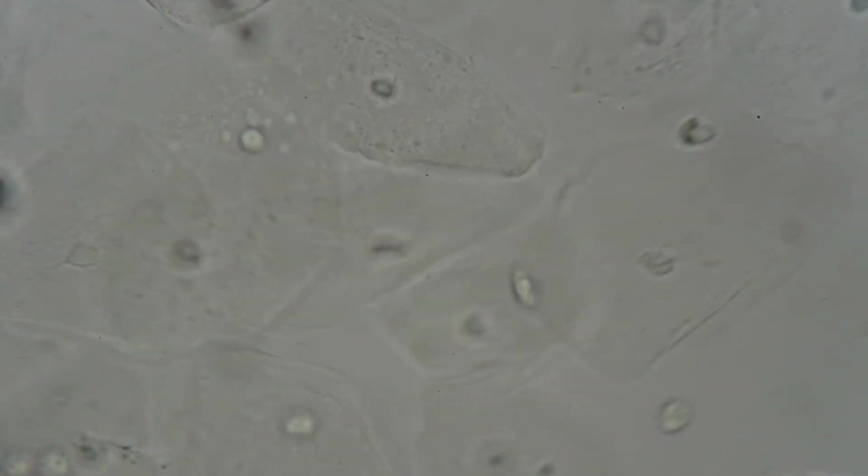Another thing that is seen in urine deposits is called epithelial cells. Epithelial cells are cells you can find on the skin, blood vessels. They are just everywhere, so they are normal when seen in urine. They are mainly found in larger quantity in female samples.